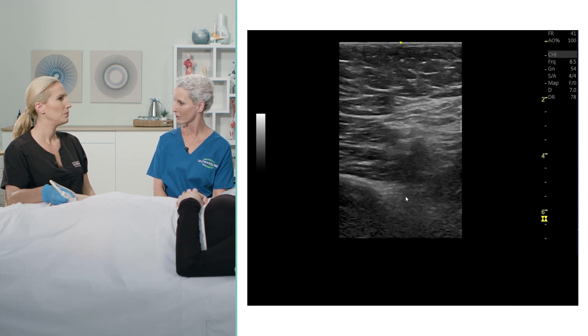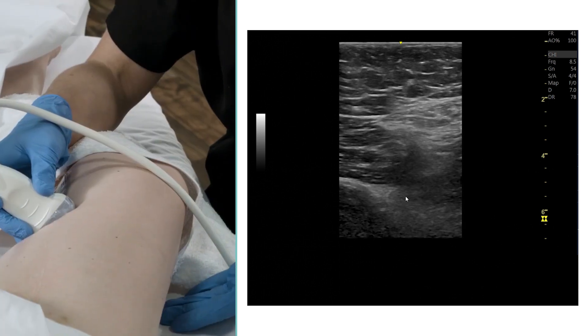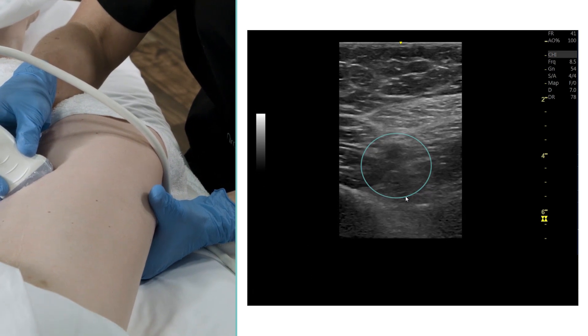Is there something else that you could try? Yes, I'm going to utilize my free hand and come underneath her posterior approach of her hamstring and compress the vein from the posteromedial portion.